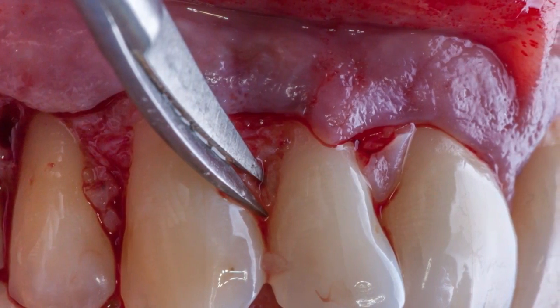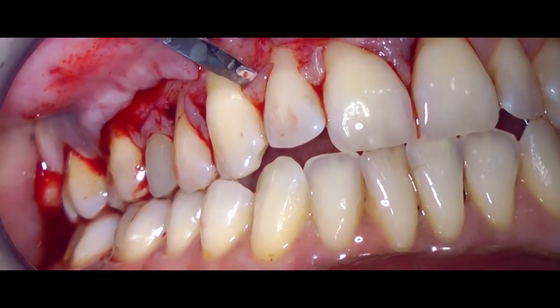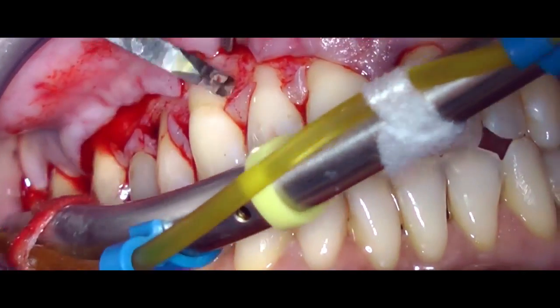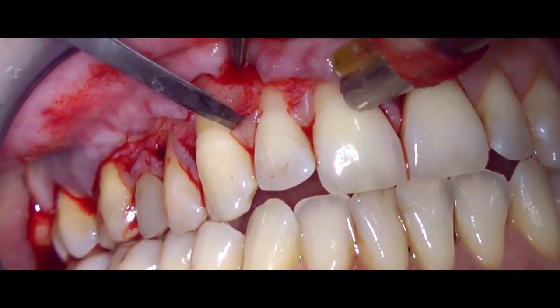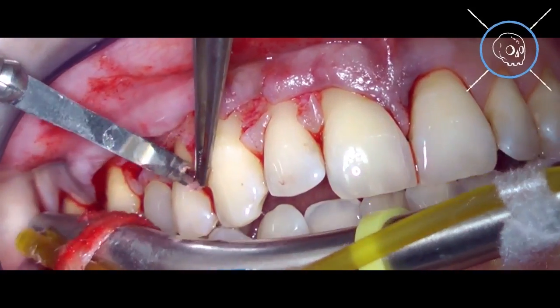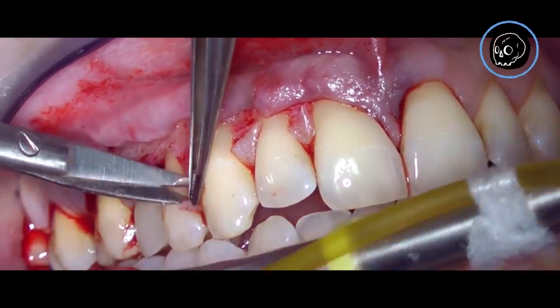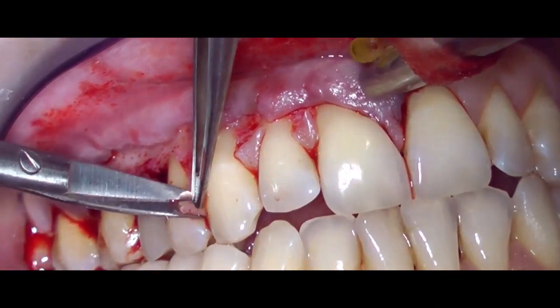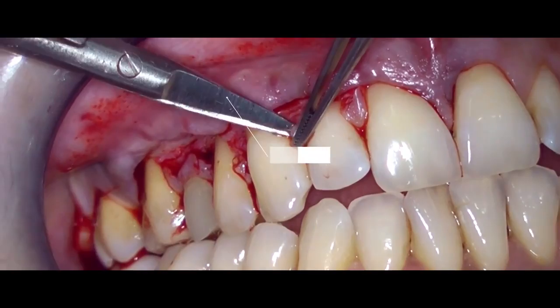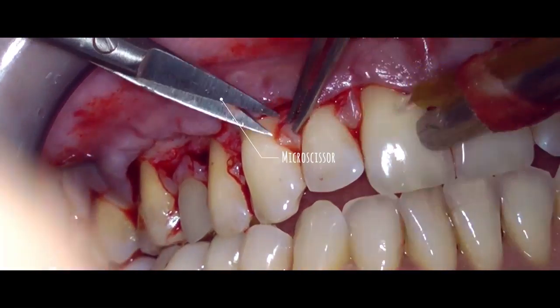The next step consists of de-epithelizing the anatomical papilla. I like to use a micro scissor or the tip of a blade; some other clinicians might prefer to use a micro blade. The important aspect is to be sure that there are no remnants of epithelium on the papilla, as they will serve as a vascular source for the surgical papilla we created.